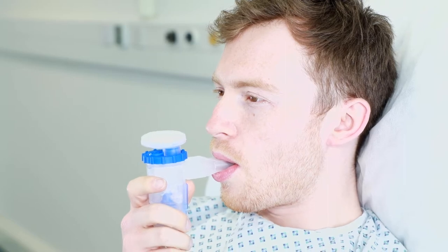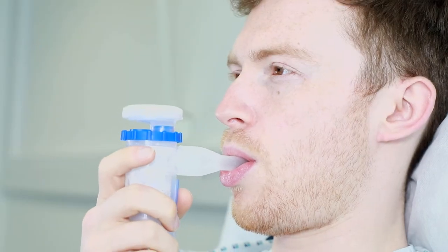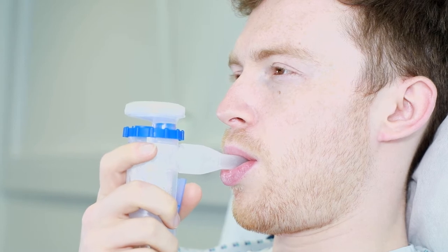When using a mouthpiece, place it between your teeth and surround it with your lips to create a seal. Position the device upright with a maximal angle of 45 degrees.